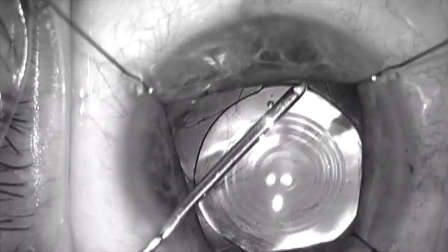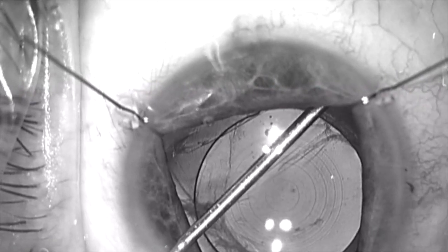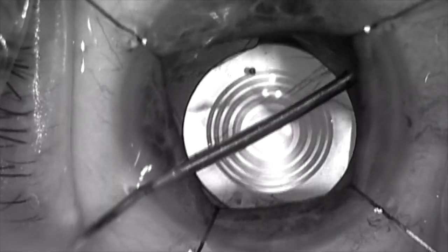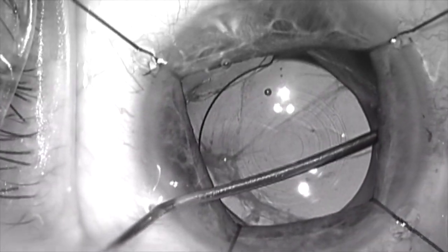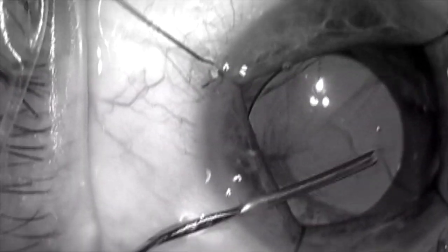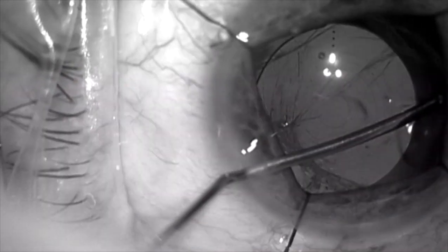I've come under that and I'm coming along the top of the haptic that's within the capsular bag to try to dissect open the anterior and posterior capsule fusion that exists here. I'm doing this sequentially, using the pressure from the viscoelastic within the enclosed space of the fused capsule to pop it open like you would blow up a balloon.